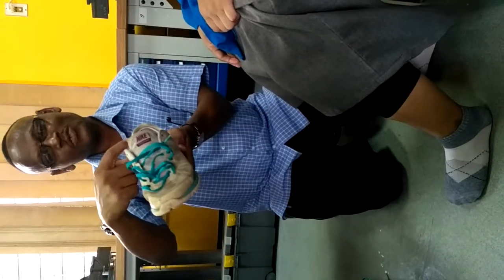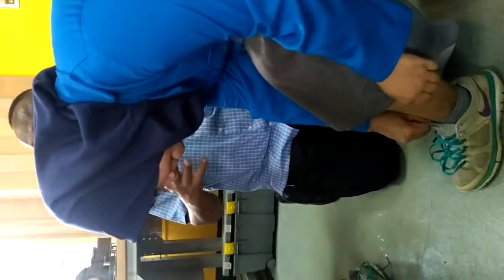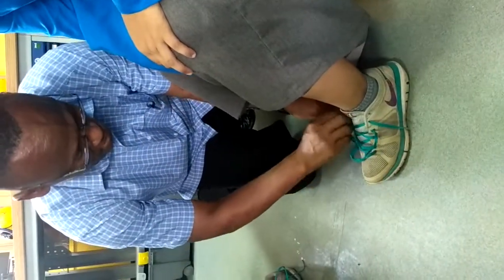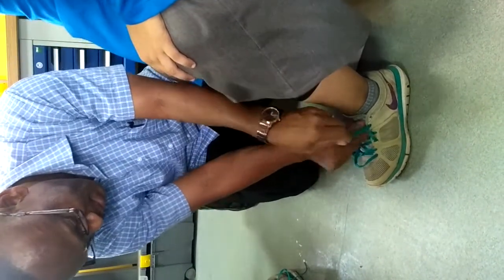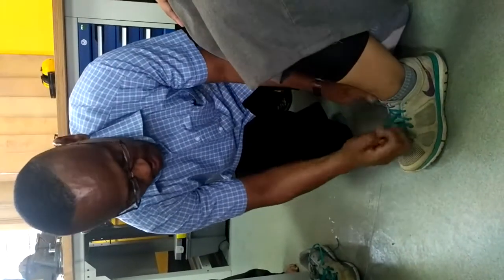Maybe it is not too visible, maybe it is too visible. It should be higher. And then you can ask the patient to don — on sitting, not standing. The patient can also help because they feel more how to manipulate the foot. Don't force it to get in. Make sure the shoelaces are tightened. Make sure the proximal part is well tightened — if it is loose, the device will be moving. We need it to be really well secured.